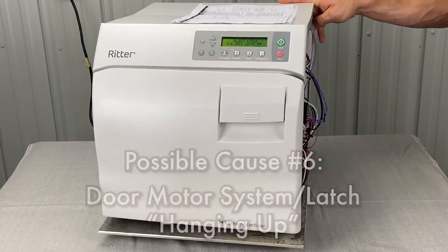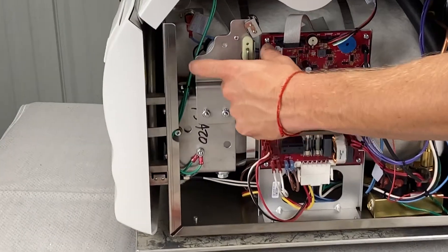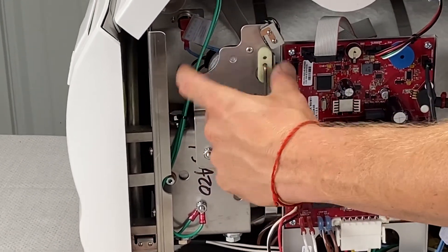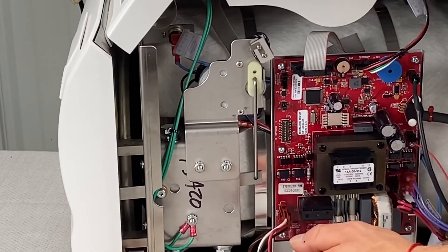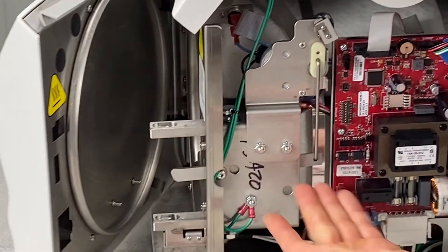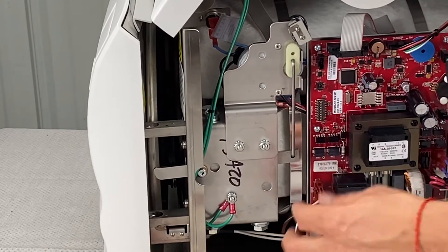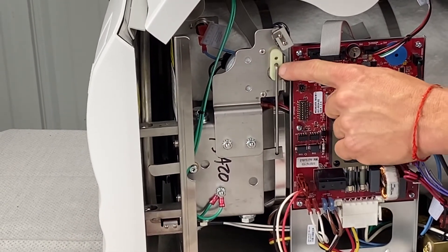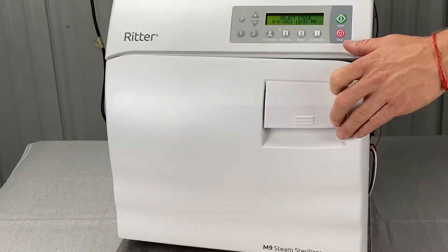Door motor systems latch hanging up is another cause. Here's your door motor — it should be positioned at an angle, more back towards the PC board. You can adjust that by loosening these screws, but make sure there's nothing impeding it — any of these wires. This is a newer unit that has ground wires. Make sure the connecting rods are in number nine instead of number eleven.